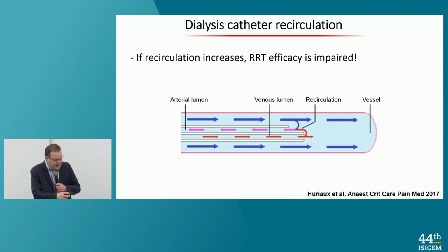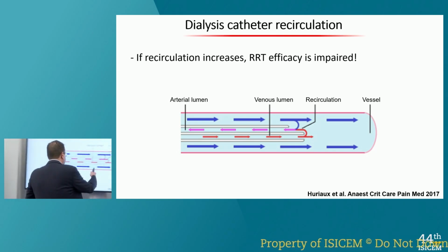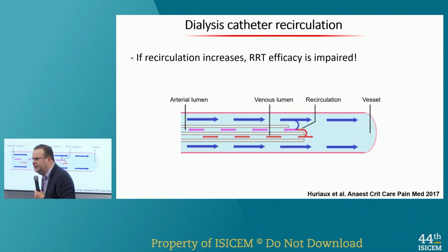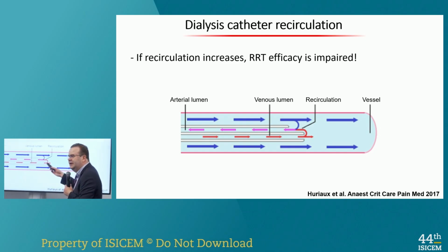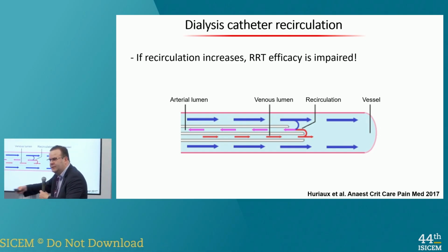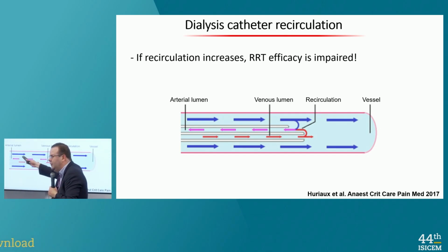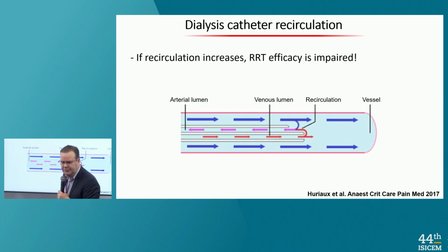Okay. Then you have the entrance of the blood in the proximal hole, right? So the blood is going inside the catheter. And then the blood is dialyzed in the machine. And then the return is on the distal side, the distal hole. And then when the blood exits the catheter, it is pushed away, because we are in a high blood flow rate location. That's why it's important to be in a high blood flow rate location.